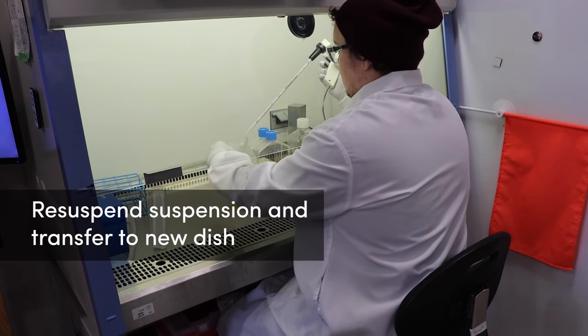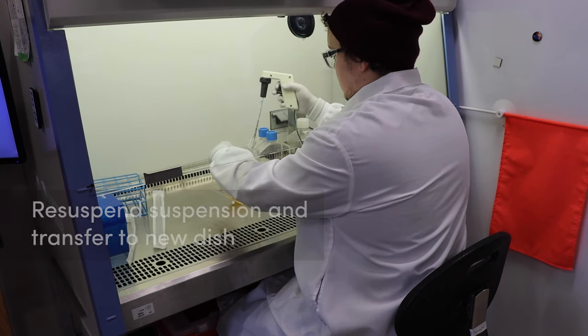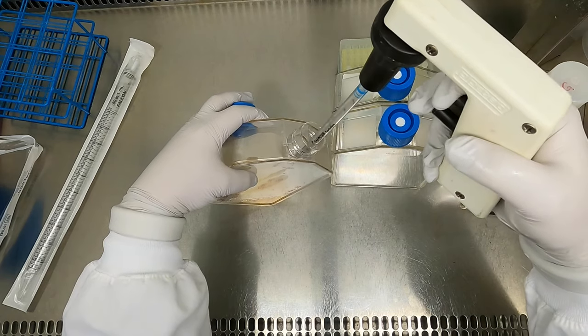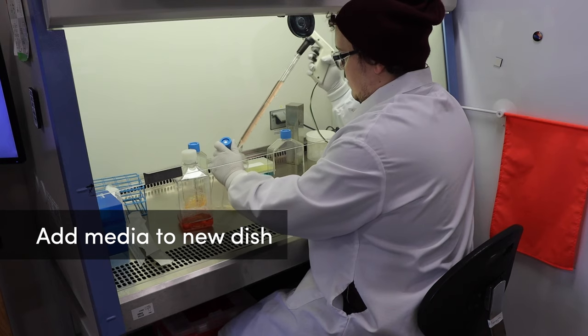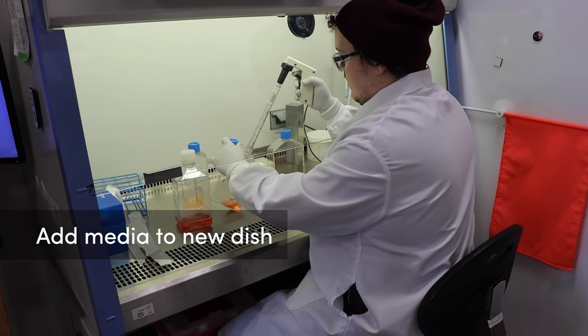If the cells are ready to be split, re-suspend the cells by pipetting and transfer the desired volume to a new cell culture vessel, which may be dishes, roller bottles, or flasks. Add enough volume of warmed media to each vessel to bring it to the desired volume per vessel, and gently mix to dilute the suspension.